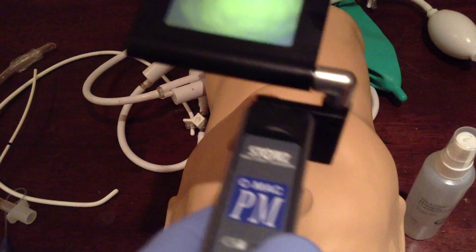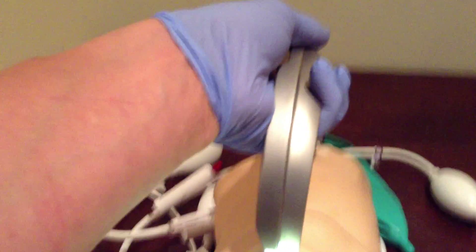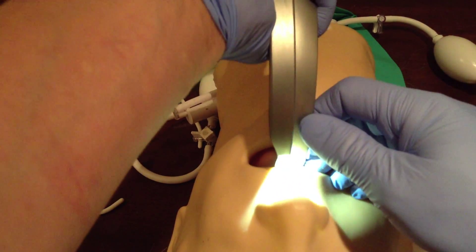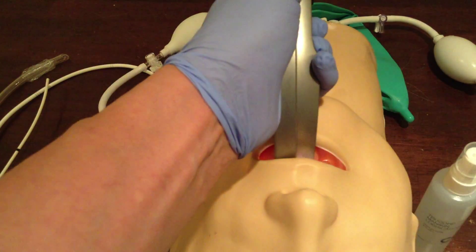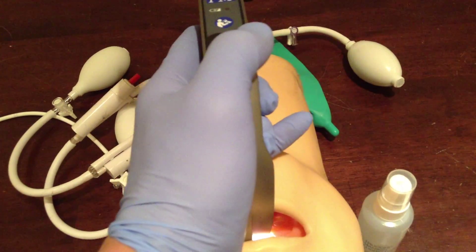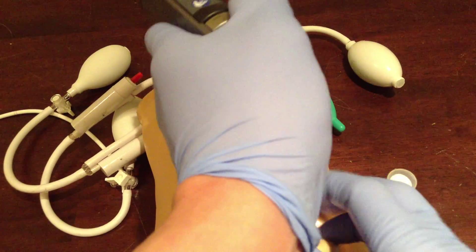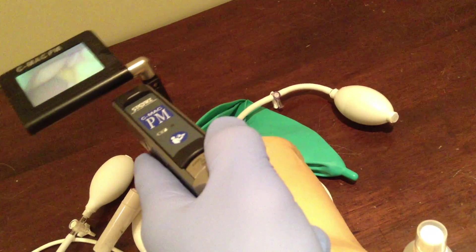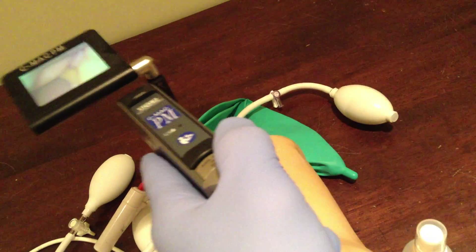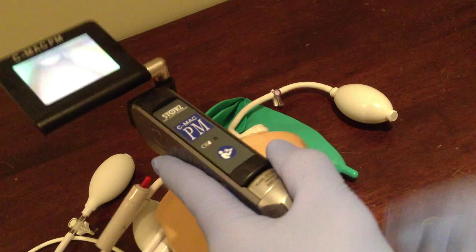Hopefully you'll be able to see the screen here. I'm going to have to play around with the camera angle. So we're going to introduce the blade in, look at the mouth, look at the screen over here. There's the back of the tongue — sorry about the bad angle — back of the tongue right there. So we're going to follow the midline until we see the tip of the epiglottis right there.